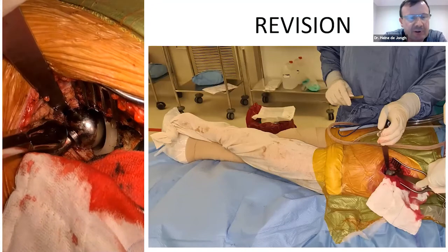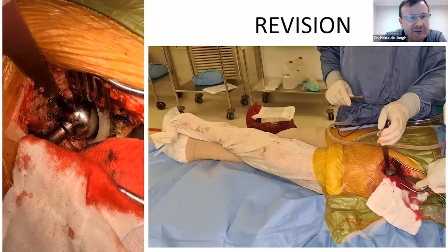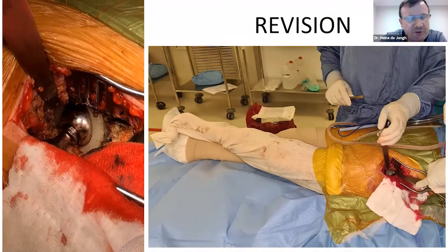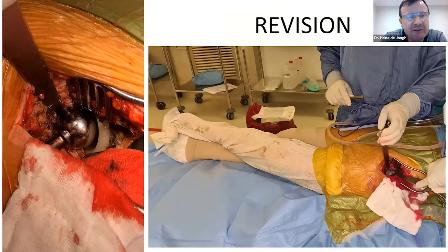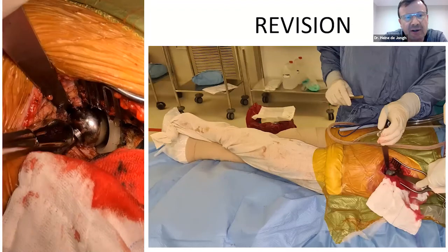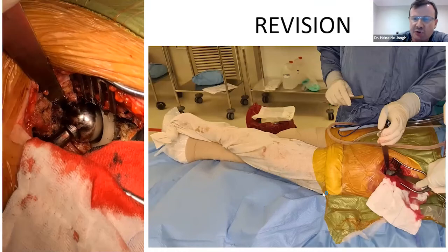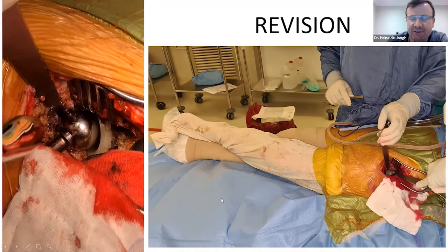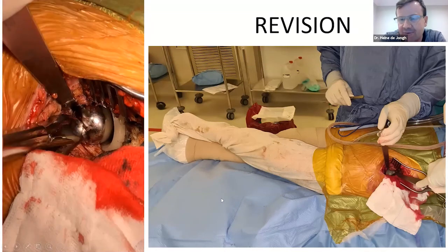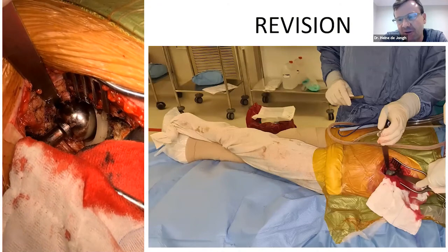This is a trick I've learned. You sometimes have difficulty getting the head off the femoral prosthesis. Give it a bit of a pull, and you knock it off in situ. Then you reduce it, you dislocate it, and you can get the head off easily. And this is the position I use when I do my acetabular revision work. I put the femur on the other side, and that makes the neck nicely tucked away, posterolaterally out of my way.